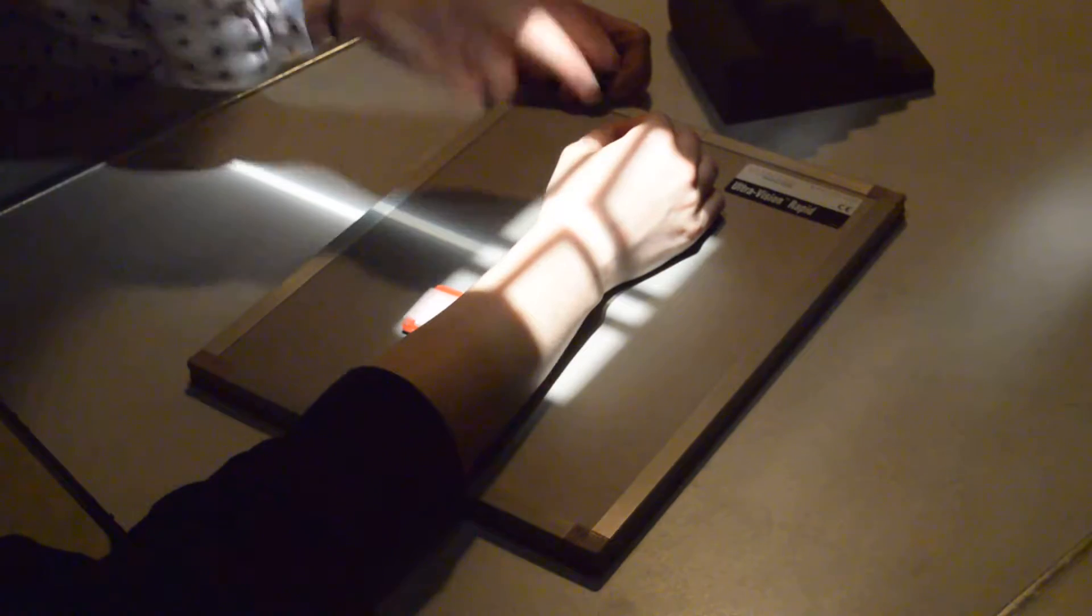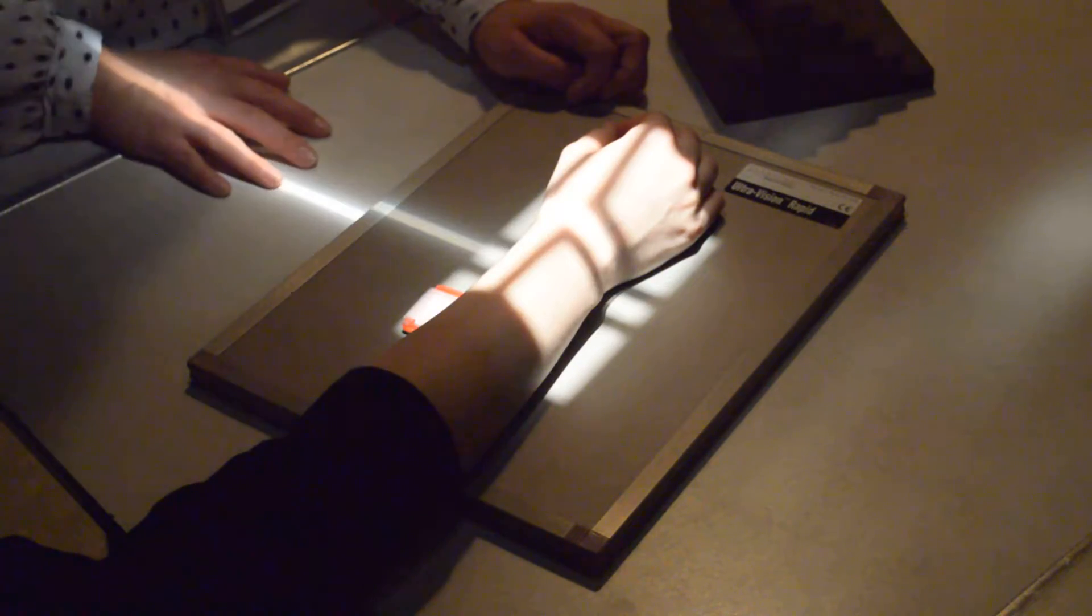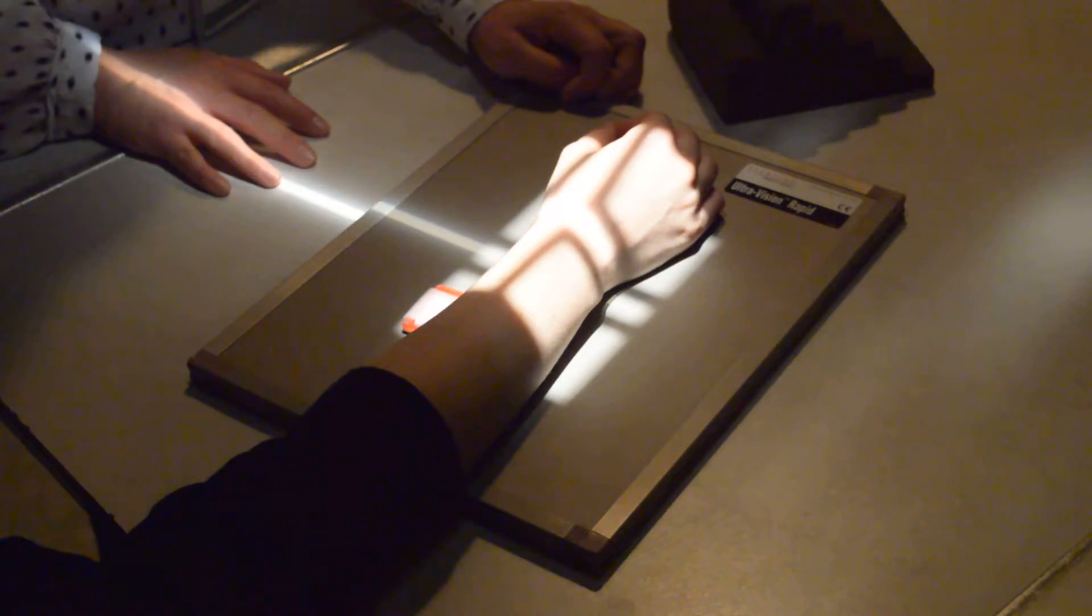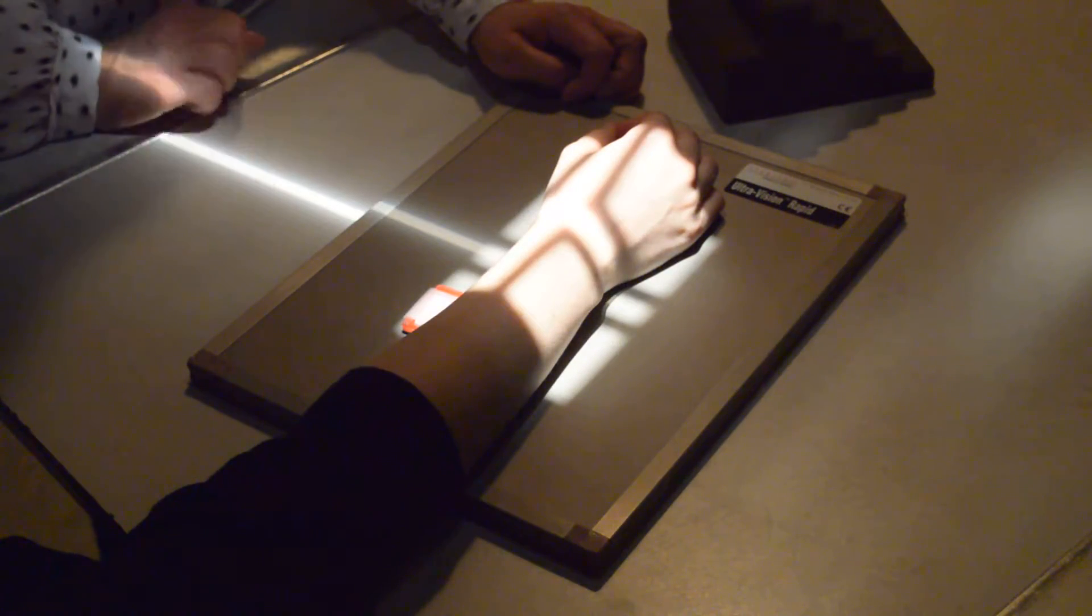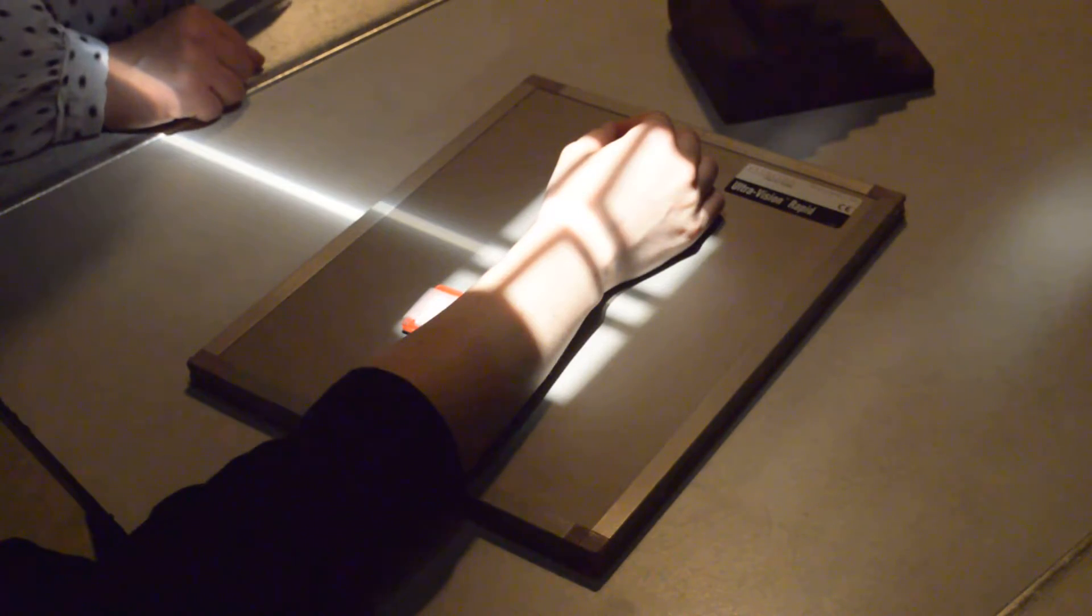You want to be at a 45 degree oblique for this. Ask your patient to hold still and click.